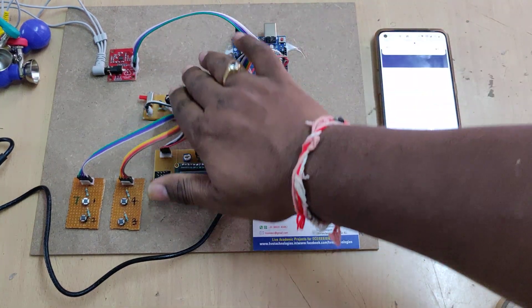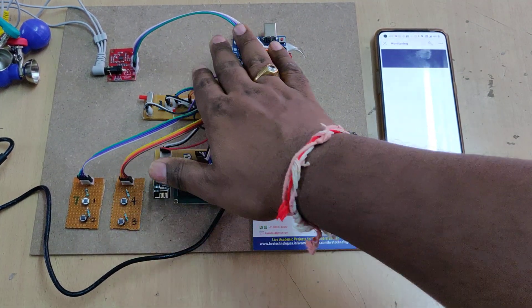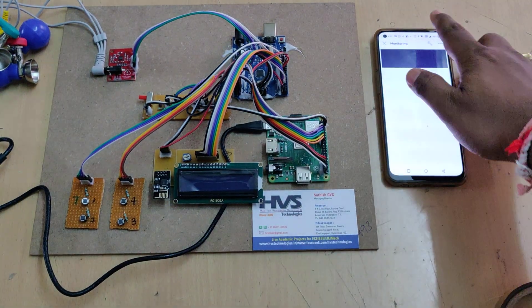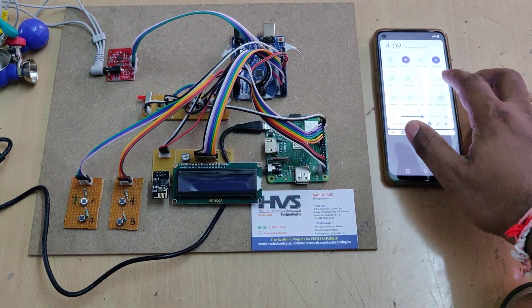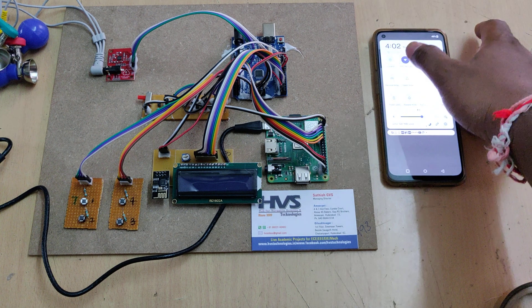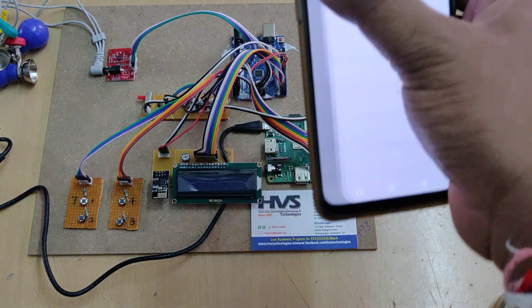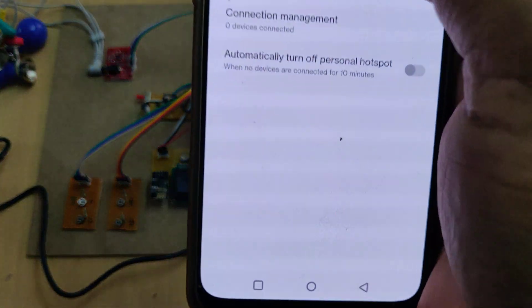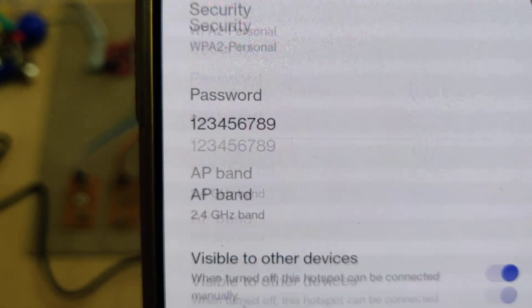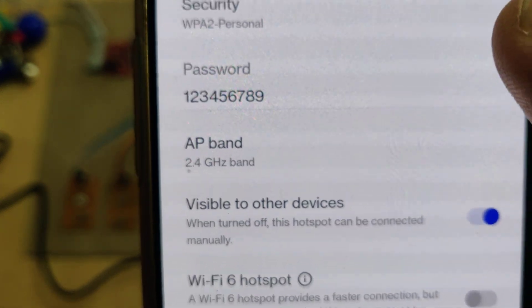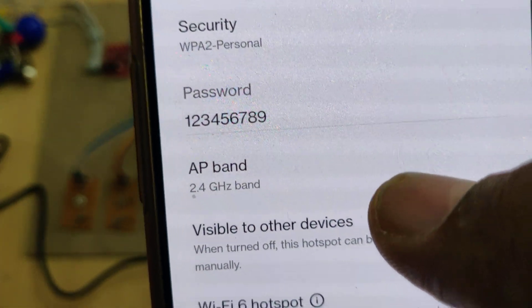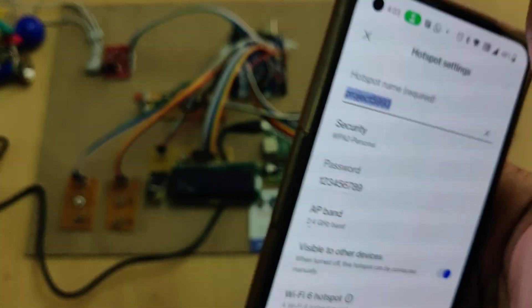This is the breadboard used for interfacing between the modules and the switch. Before turning on, you need to enable the hotspot on your phone. Change the hotspot name to 'project5993' without any space or capital letters, the password should be '123456789', and the AP band should be 2.4GHz.